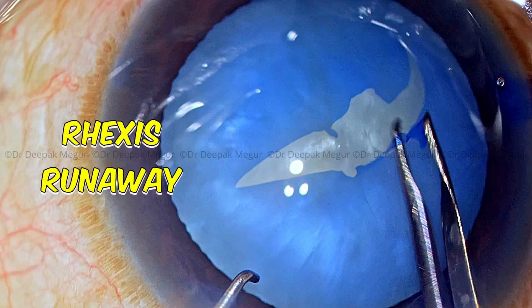The capsular bag is relatively decompressed now — the anterior capsule is no longer under stress, so we have enough time to go back. I'm going to change to forceps and then perform the initial primary rhexis. Using the forceps I'm going to create the initial smaller rhexis, using a combination of tearing technique and shearing technique depending upon how the capsule is behaving. The moment I feel the capsule is losing control I resort to the tearing technique, and as soon as I feel it's all right I resort to the shearing technique — basically folding the capsule and then tearing it. The initial 4mm rhexis could be created with no issue at all.